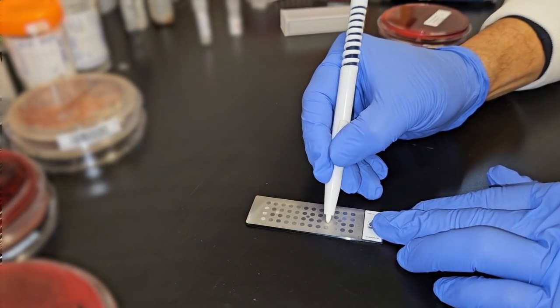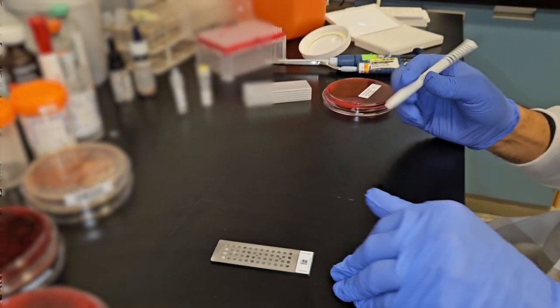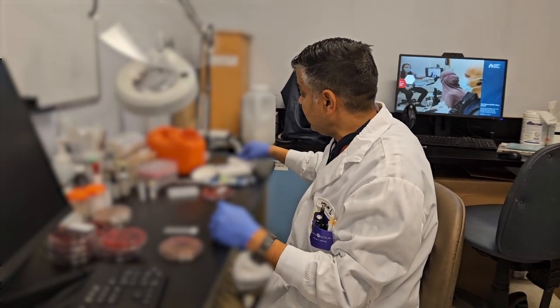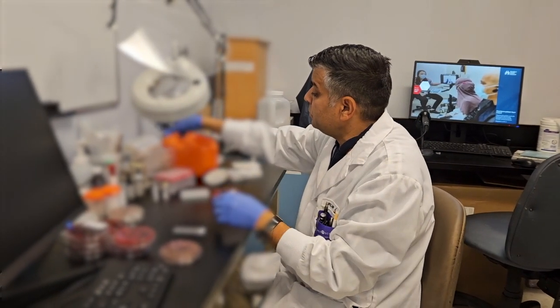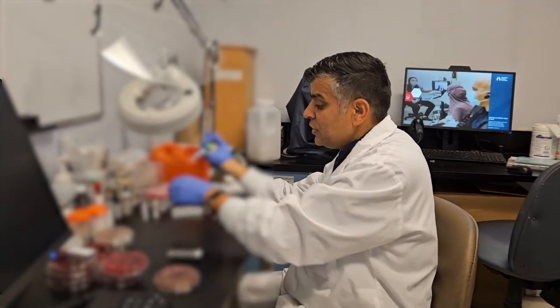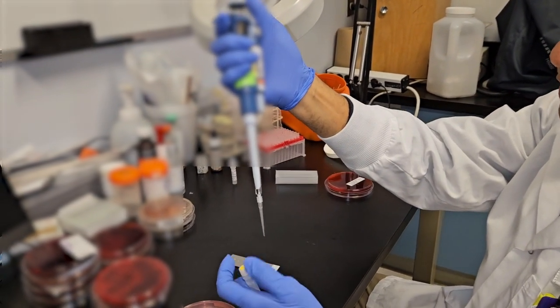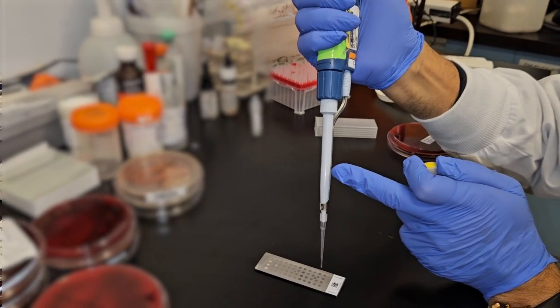It's really tricky mass spec by this method. The success of MALDI depends upon your smear quality. The thinner the smear you make it, the better the chance of getting identification. So far I have put my bacterial smear on the target slide. After that, since this is MALDI-TOF, it involves the use of matrix. I'm putting matrix solution onto those spots, which helps to release the bacterial cell, to release the DNA content, the protein content of the cells.